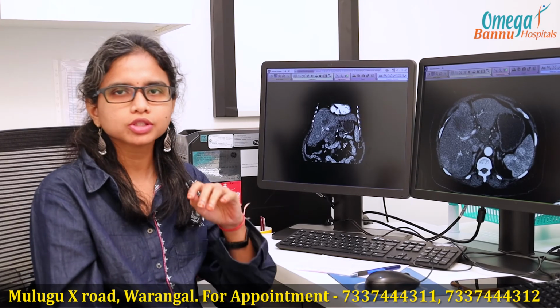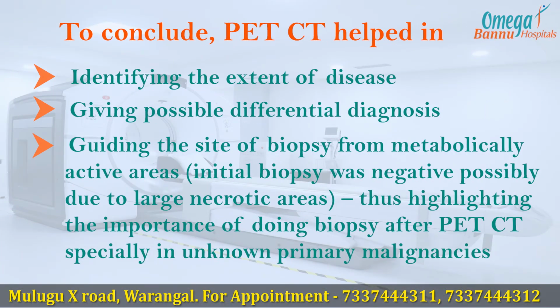So the highlights of this case are the possible diagnosis being metastatic multifocal hepatocellular carcinoma versus intrahepatic cholangiocarcinoma. The other important clue which the scan gave us is guiding the clinician to the site of biopsy.